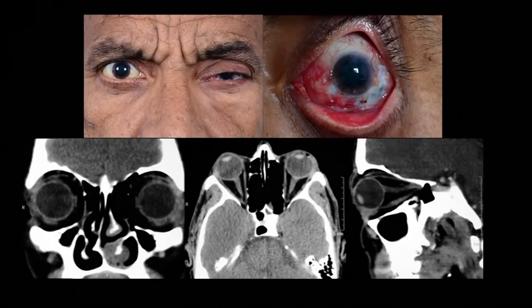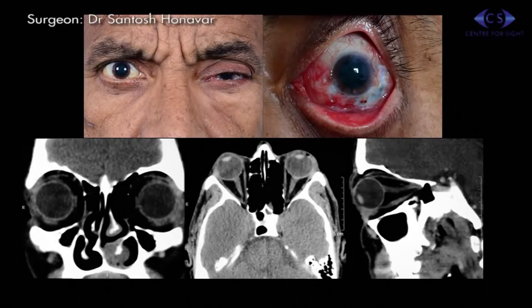This video demonstrates the eyelid-sparing orbital exenteration in a 55-year-old male with orbital extension of conjunctival squamous cell carcinoma, also known as ocular surface squamous neoplasia.